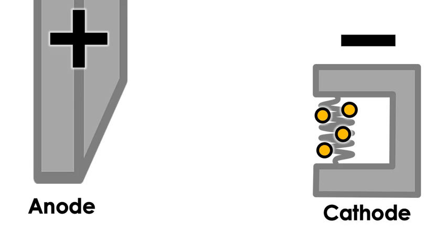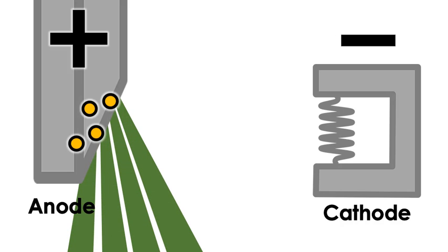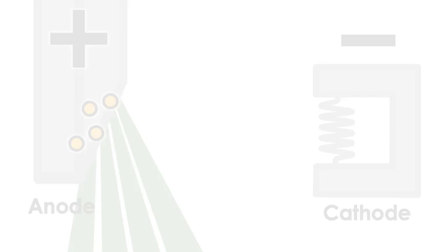Free electrons are created at the cathode filament through the process of thermionic emission. These electrons are accelerated through the X-ray tube by a voltage, that's the kVp. These electrons are decelerated when they interact with the tungsten atoms in the anode target, and through that process, they create X-rays. Bremsstrahlung radiation is one of the processes through which these X-ray photons are created. So here's how it works.